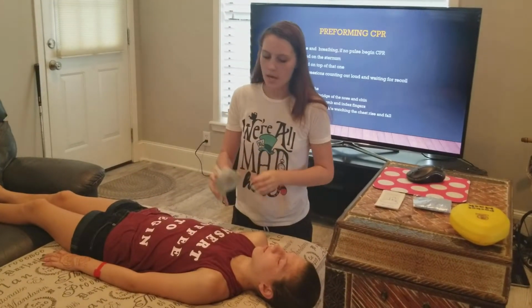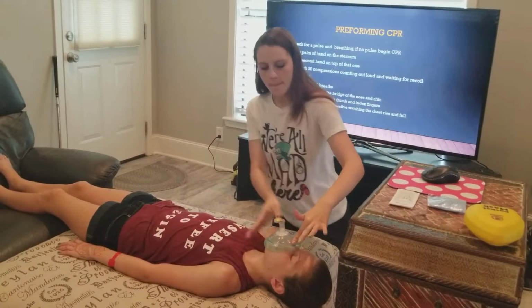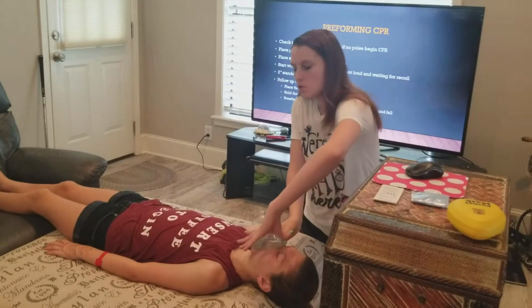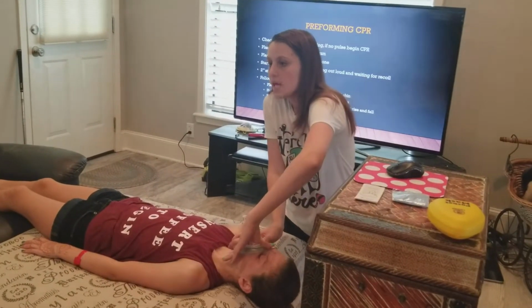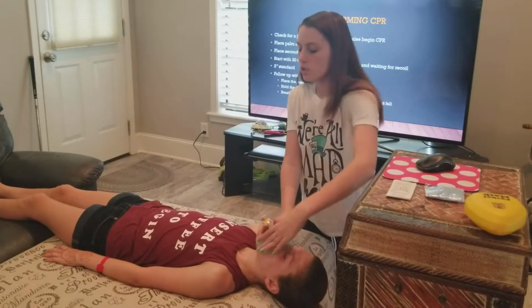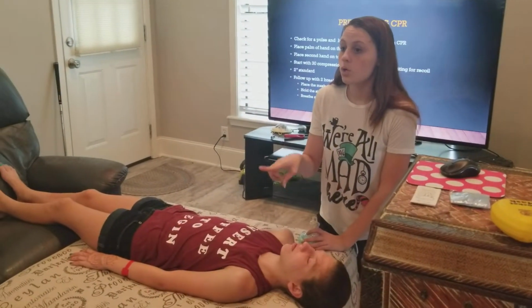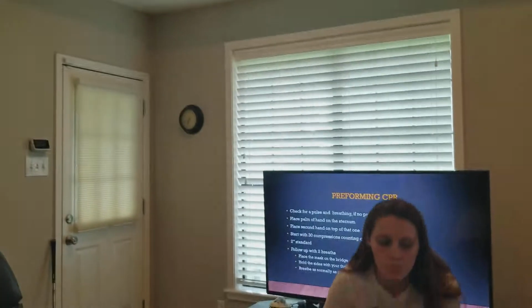You put the pocket mask on the bridge of the nose and the chin, and use your thumb and your index finger to create an airtight seal, giving 2 breaths as normally as possible. You should look for the chest to rise and fall. If the chest does not rise, you are not giving enough air.